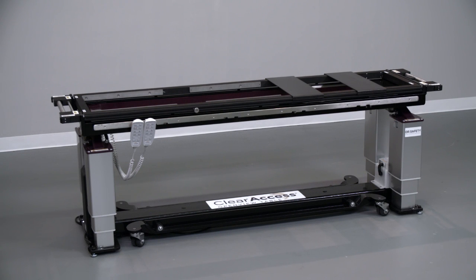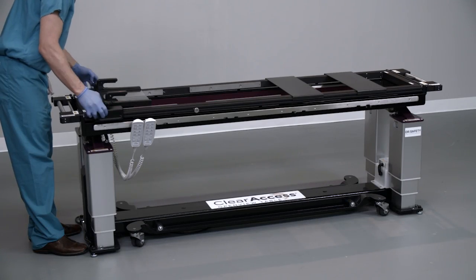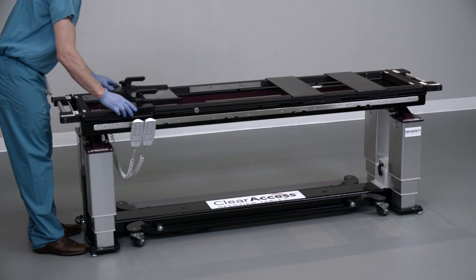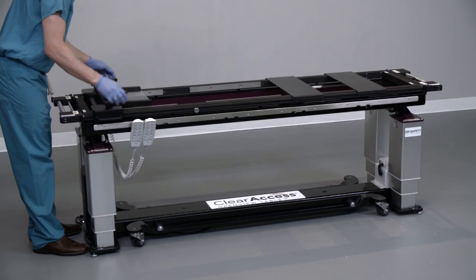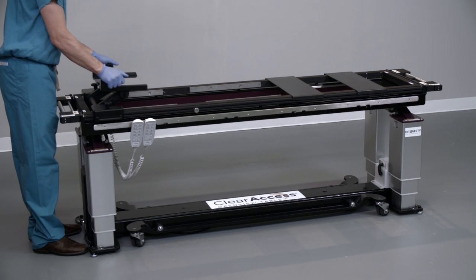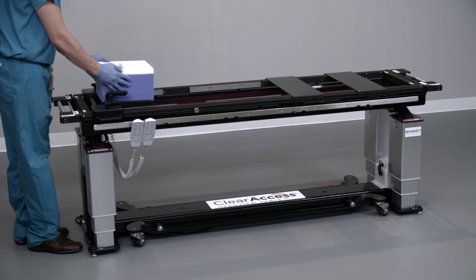Install the Clear Access head support by grasping the installation handles on either side of the device. Hover the head support over the head end of the table and pull outward on the installation handles. Place the head system onto the prone platform and release the handles. Verify that the head support is engaged by lifting up on the handles without pulling outward. Slide the head support to the desired location and lock in place by tightening both locking knobs. Adjust the height and pitch of the support plate by grasping both control handles and squeezing firmly to release the lock before making adjustments, then release the handles at the desired position to automatically lock it in place.